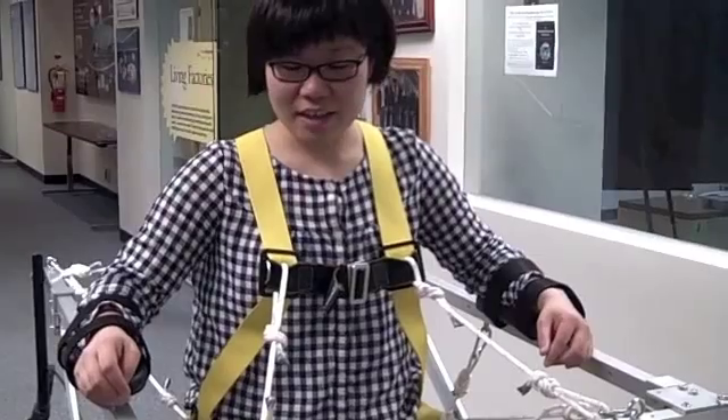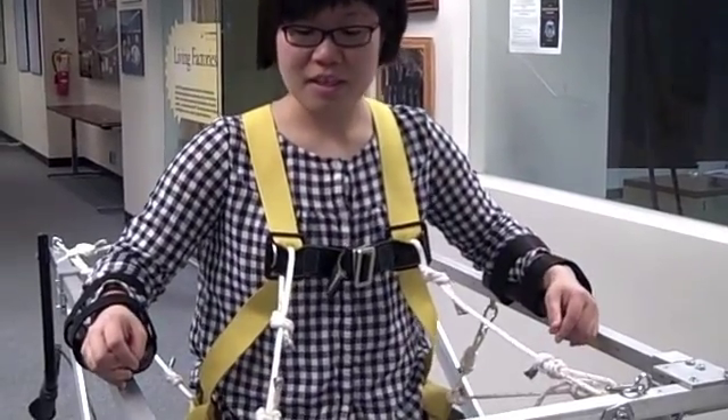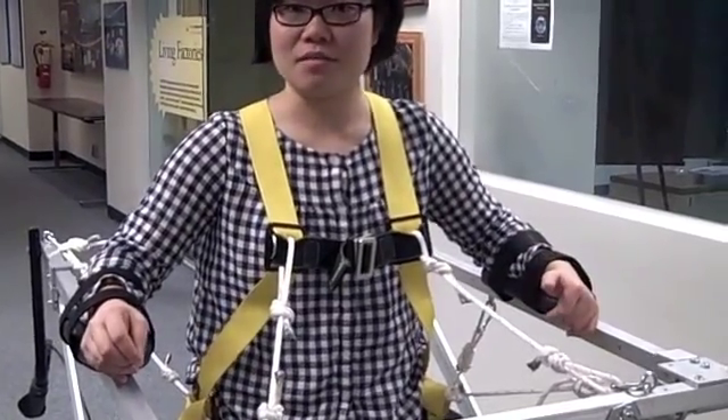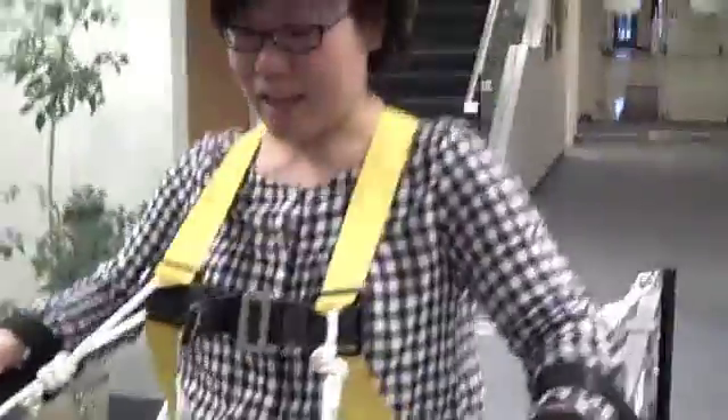I'm wearing a full-body harness. It has a place to attach rope to the front and back of the gait trainer to provide lower body support through these ropes, and upper body support that will prevent me from leaning back and then forward.